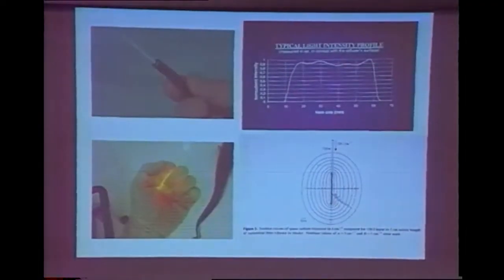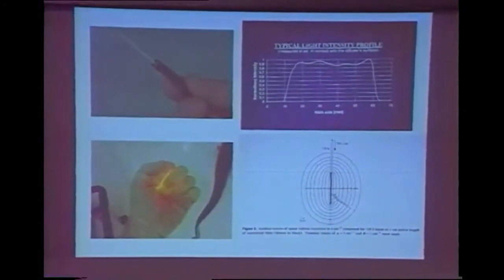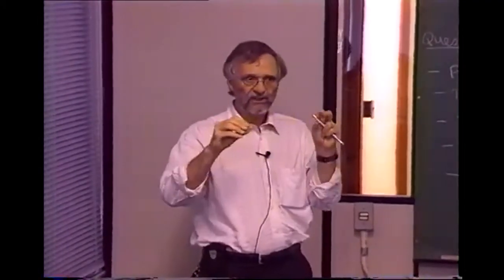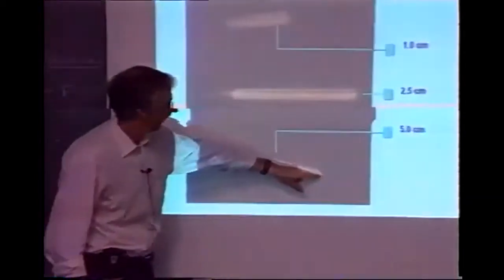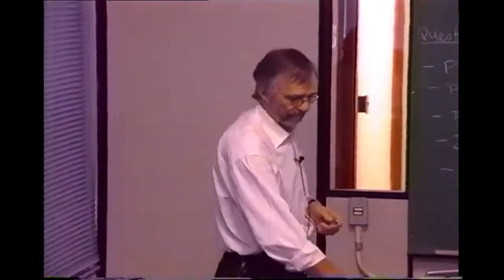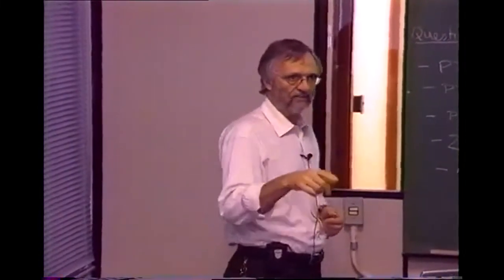Why are they so expensive? Well, they're actually not that easy to make, with very tight specifications. You have to take the fiber, strip the cladding, coat it, and re-clad with a transparent cladding so that it's still strong. In some cases, you have to add a sharp tip so that you can go into the tissue. And there's a lot of work in making one of those. I'll show you tomorrow an alternative technology that we've developed that might be much cheaper.